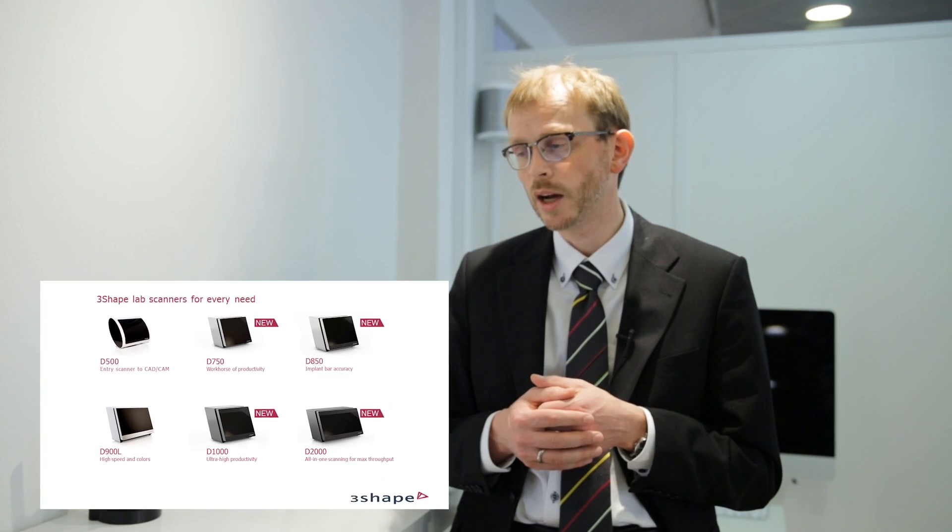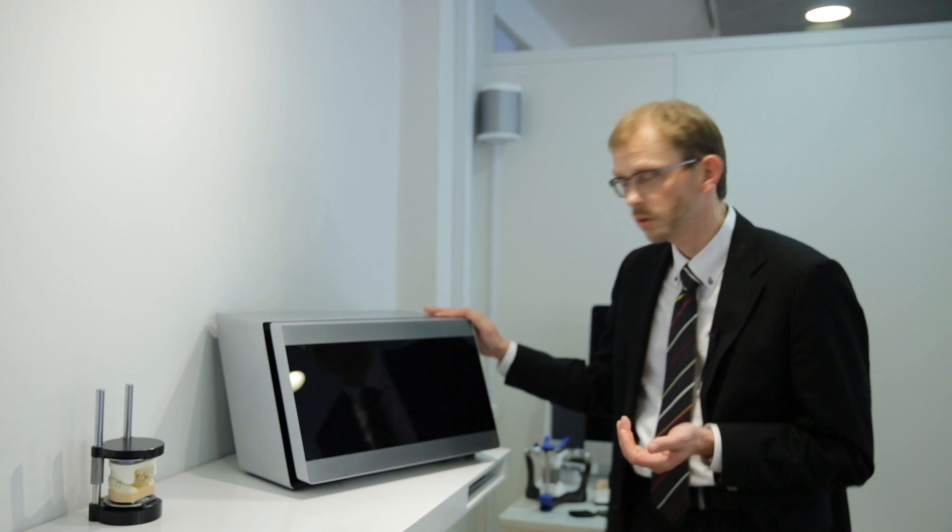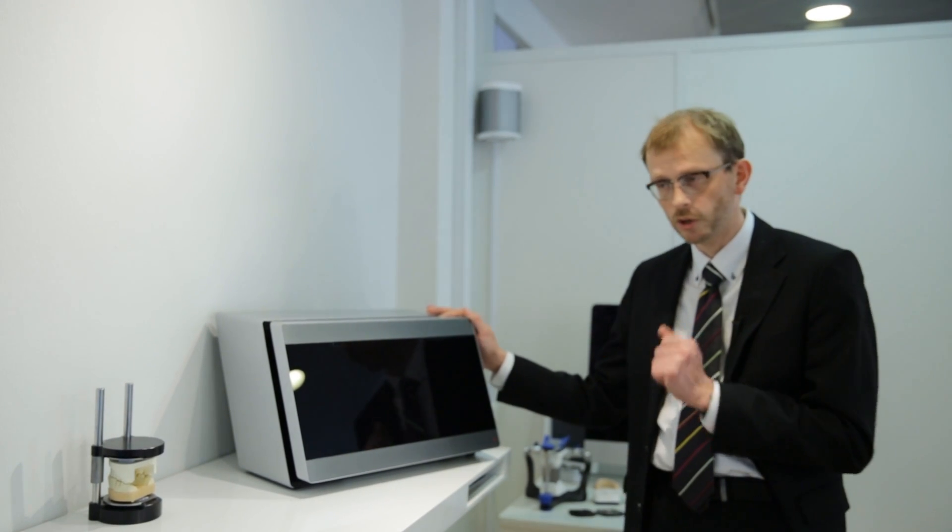You really get high productivity with these two scanners. I actually brought the D2000 scanner here so you can see it — I'm going to come back to that in a little while. First, I'll tell you about the upgrade that we did for the mid-range.